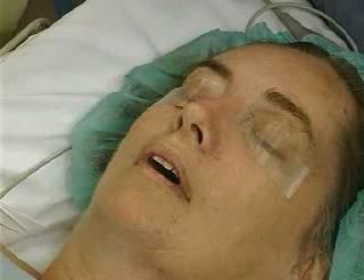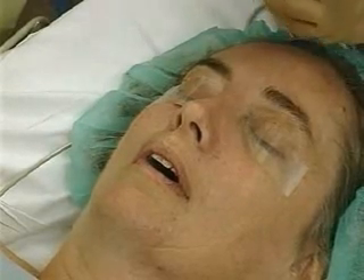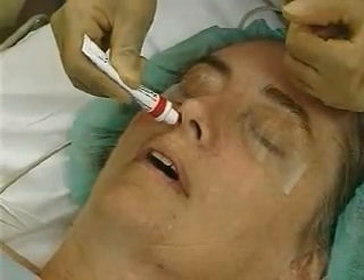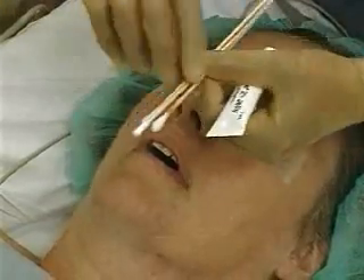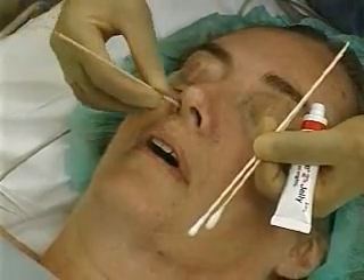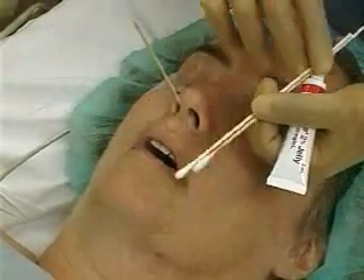Anesthesia is administered when placing the nasal airway device. The patency of the nares should be gauged by inspection and the mirror test condensation. A topical slurry composed of 10 milligrams phenylephrine in 10 milliliters of 2% lidocaine jelly is applied; this provides anesthesia and vasoconstriction of the nasal airway. The lidocaine jelly mixture is swabbed just inside the external edge of the nares until local anesthesia occurs.